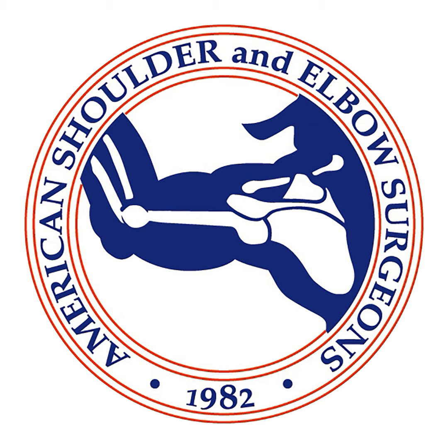They are much easier to remove than a stemmed implant. I will say that. Most stemless implants are porous coated and really get outstanding ingrowth. So every one that I've taken out that's not loose has had a high percentage of bone ingrowth on the porous surface. You don't end up with a huge amount of bone loss.